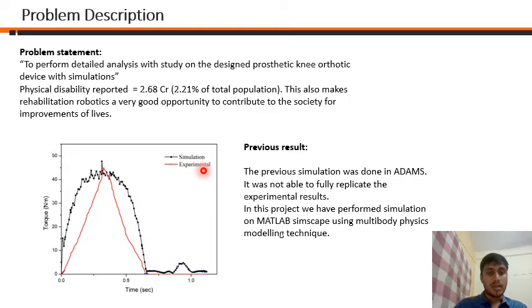Previously, it was carried out in Adams software with limited detail, and now I have used MATLAB Simscape, which is a multi-body physics modeling technique. I have also attempted to fully simulate the walking of a human with this device attached to his left leg.